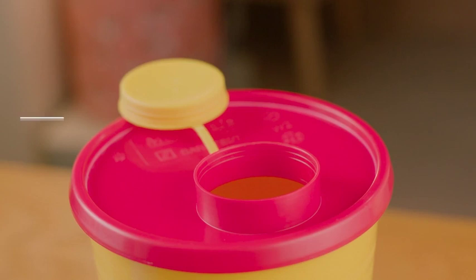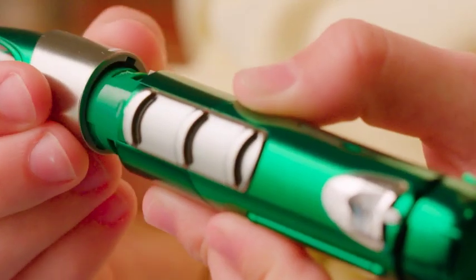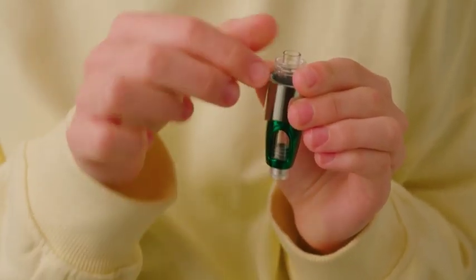When this happens, follow the instructions in video 6 to safely remove and discard the needle. Then unscrew the locking ring and push on the end of the cartridge to remove it from the locking ring.